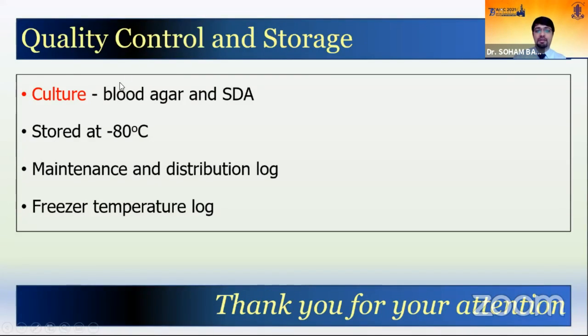Along with it, what are the quality controls? We look at the culture: blood agar and Sabouraud's dextrose agar are cultured, and the tissues, the amniotic membranes, are released for surgery only once both the cultures are negative. And the logs to be maintained are a freezer temperature log and a maintenance and distribution log. This is for your quality control purposes.